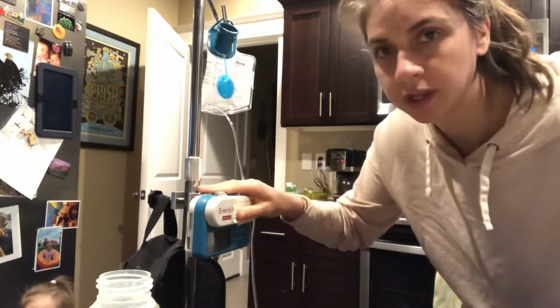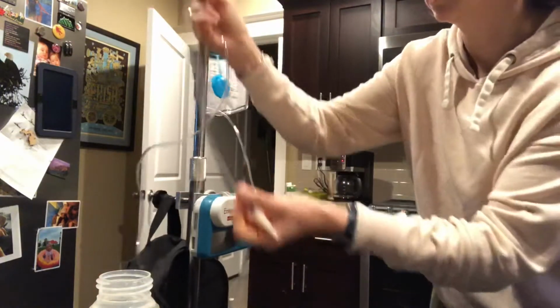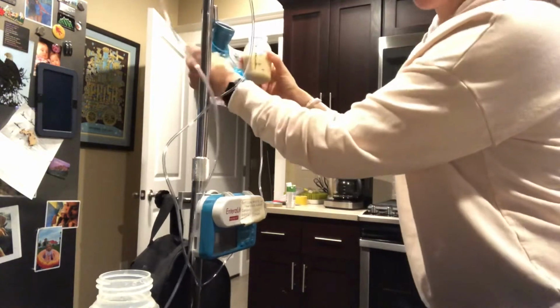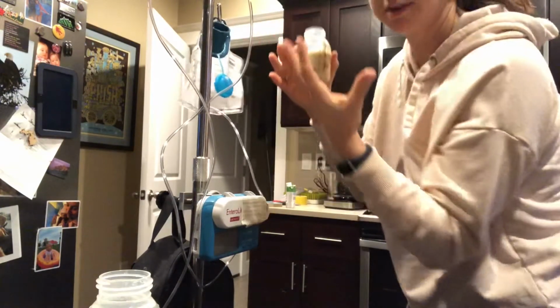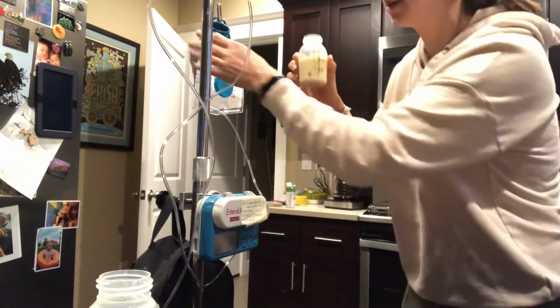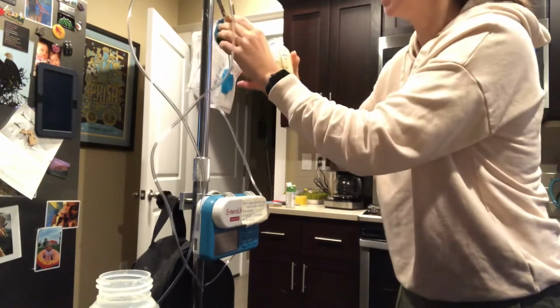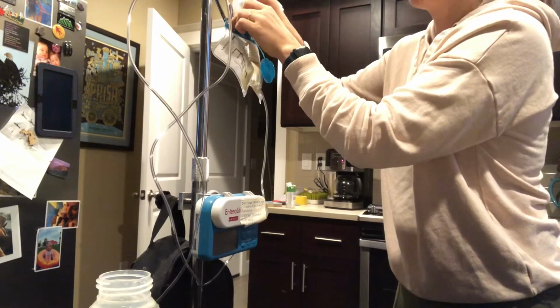So this is the pump with the bag, and what you're going to do is just take the formula that should be already pre-mixed, and when you pour it in the bag, it does kind of suction itself closed on the back. So you've got to make sure you have clean hands, hand wash, and then sanitizer. And then you have to just kind of open it a little bit with your finger, just kind of push it open. You'll see it when you actually see the bag. So that it's open, and then pour the milk in.